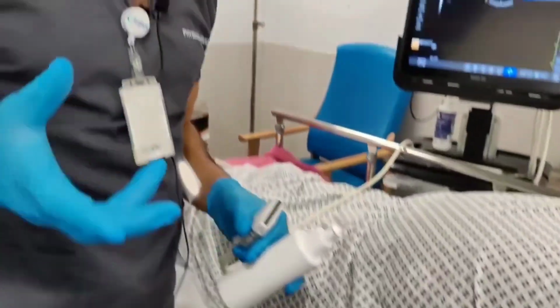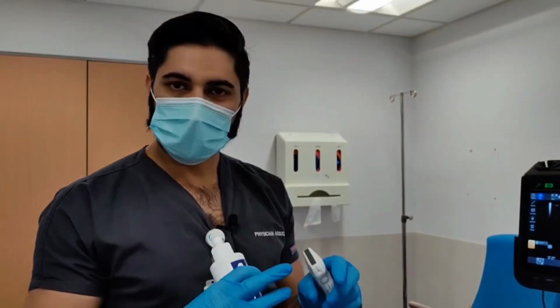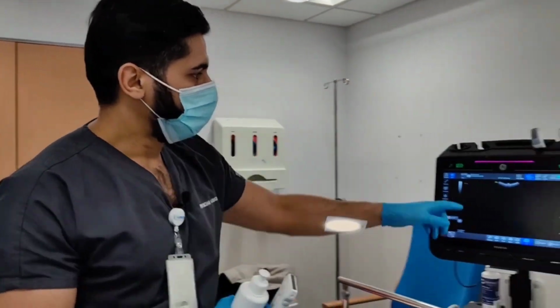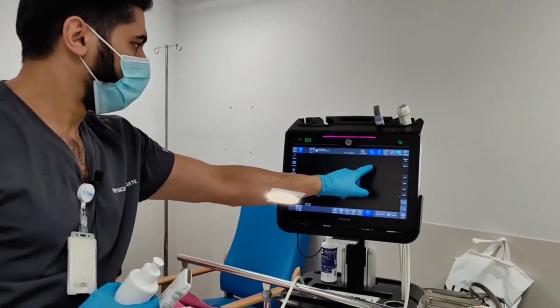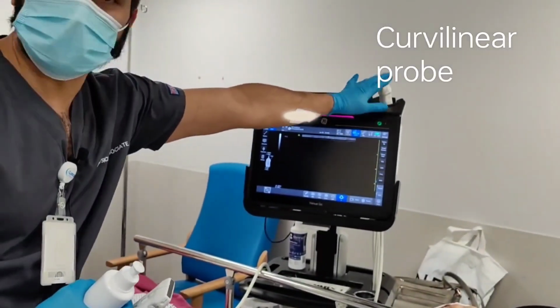Okay, ultrasound-guided IV cannulation, ultrasound-guided IV access. First things first, get the right probe. We select the right probe on here. We've got 3 probes on this one. That's usually for fast scans, that's usually for the cardiac.